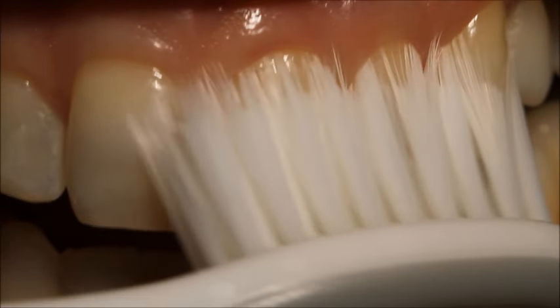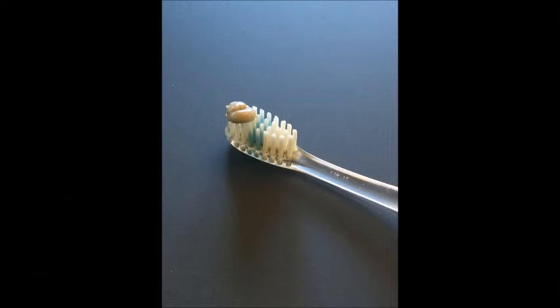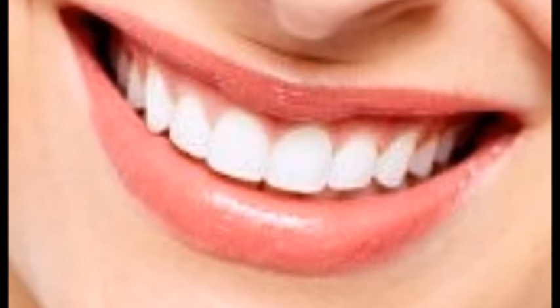Brushing like this will take about two minutes to get through the whole mouth. For demonstration, we're showing without toothpaste. Whatever toothpaste you prefer, just use a small pea-sized drop on your brush. Still, this doesn't reach very effectively between the teeth, which is why flossing is important.